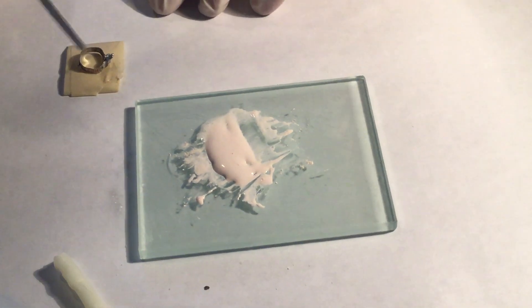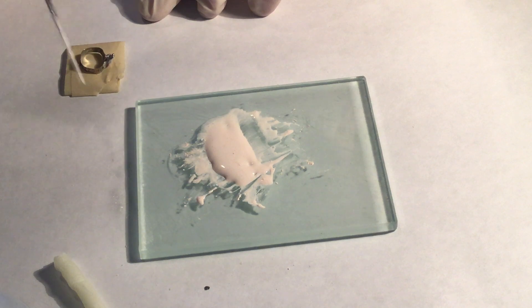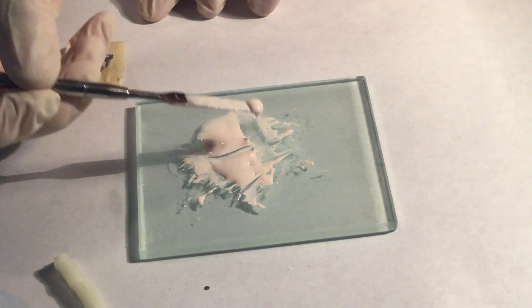Load the orthodontic band with the spatula, coating the inside of the band.